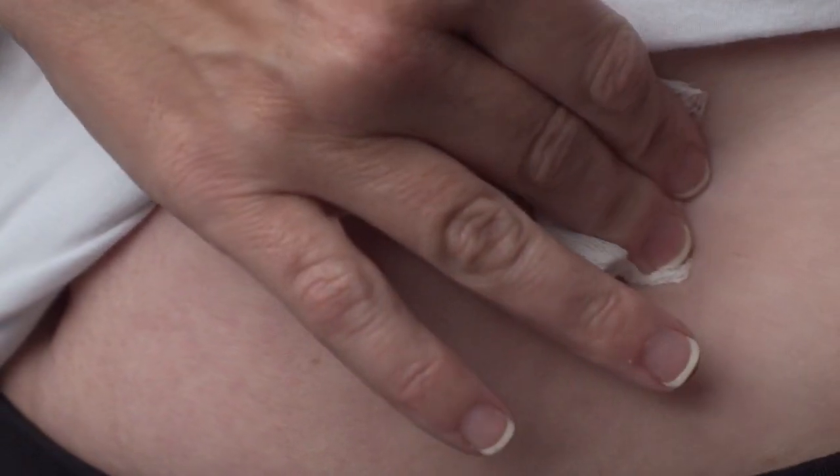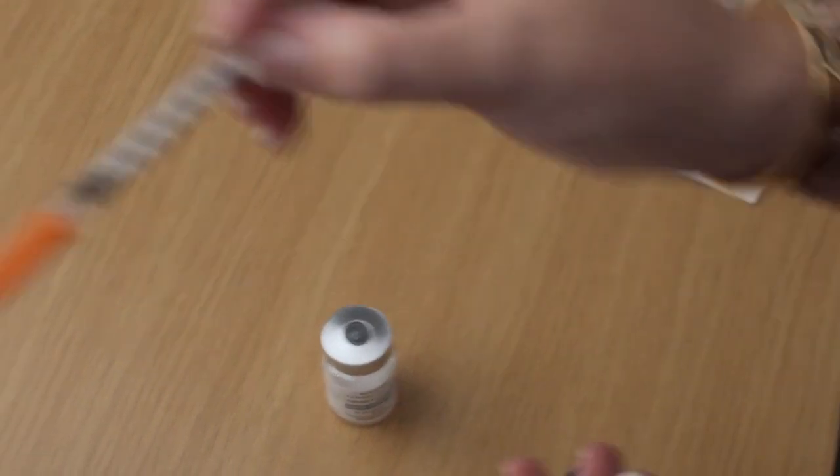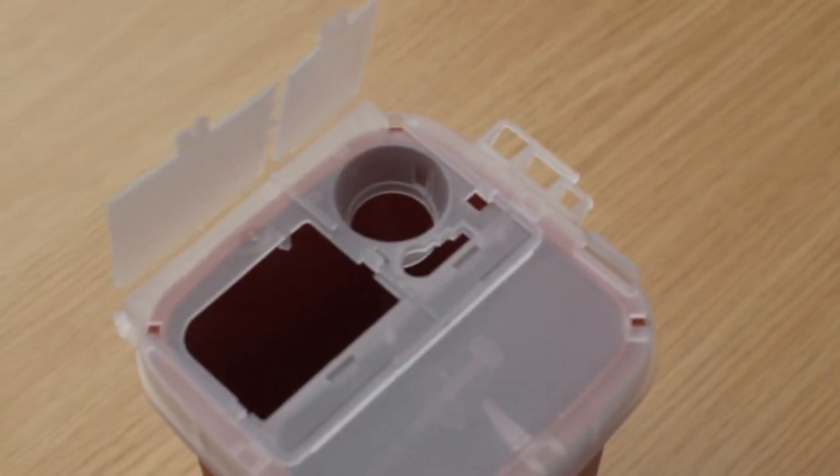If necessary, apply a band-aid to the injection site. Once your injection is complete, dispose of the used needle and syringe in your safety container.